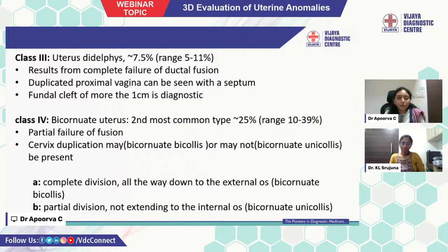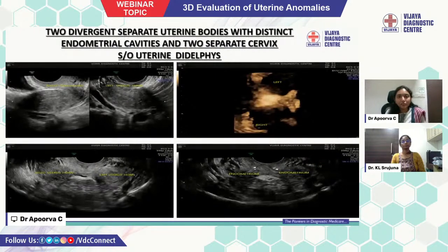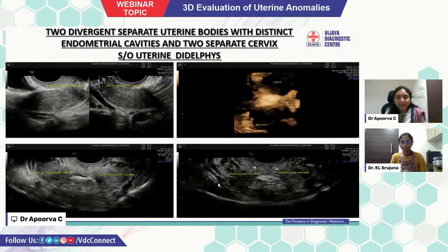Class 4 is bicornuate uterus — the second most common type, ranging around 25%. It is partial failure of fusion; cervix duplication may or may not be present. It is divided into complete division all the way down to the external os, partial division not extending to the external os, and internal os. This is a case showing uterine didelphys, where two divergent separate uterine bodies with two separate endometrial cavities and two separate cervices can be seen, suggestive of uterine didelphys.